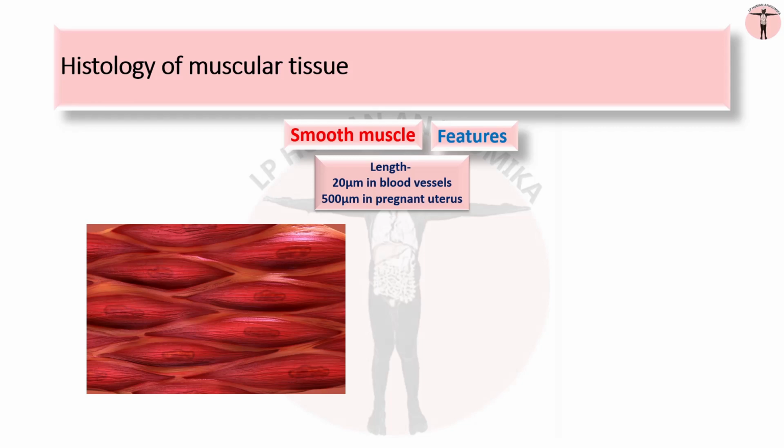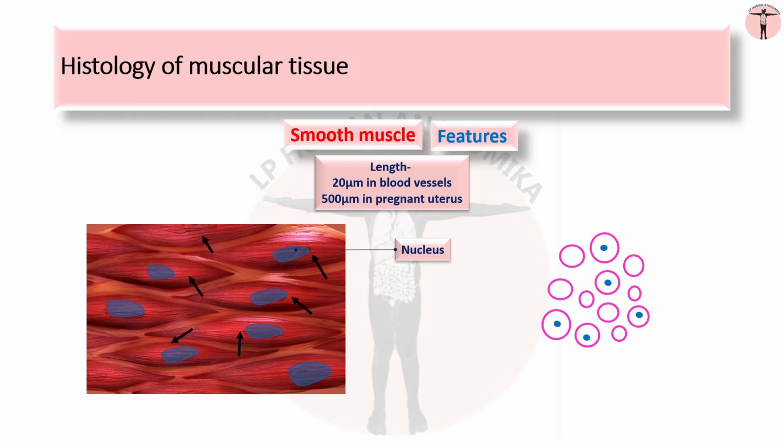Each smooth muscle fiber or cell, which is spindle-shaped, has a single long nucleus located in the center of the cell's central broadest part. The cells taper uniformly along their lengths, and to achieve the tightest packing, the narrow part of one cell lies adjacent to the broad part of neighboring cells. Such an arrangement viewed in cross section shows varied size of cell diameters, with only the largest sections at the broad part containing a nucleus. All cells are linked by numerous gap junctions.